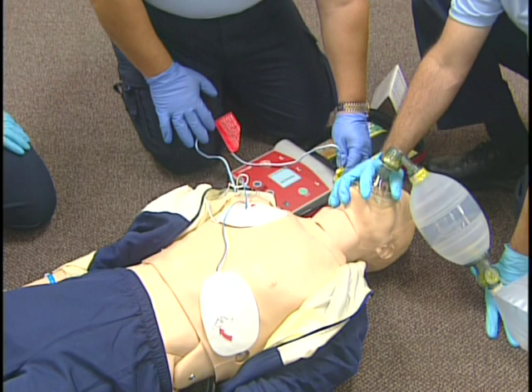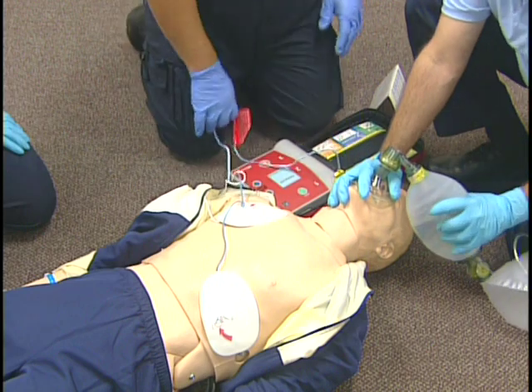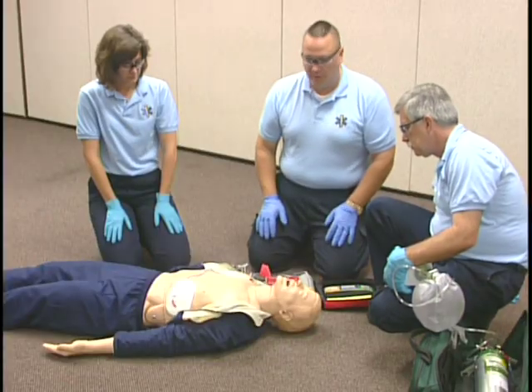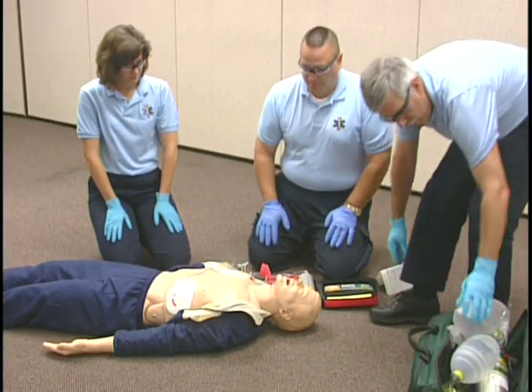Stop CPR. Clear everyone away from the patient and initiate the analysis of the rhythm. Okay, everybody clear? The unit will advise you whether to shock or not to shock the patient. Follow the advice of the AED and push shock if indicated.